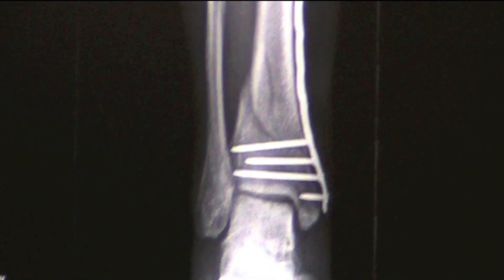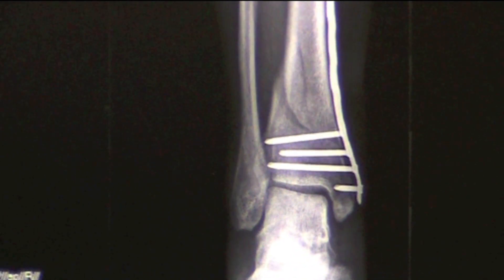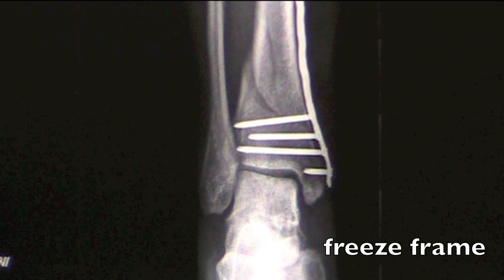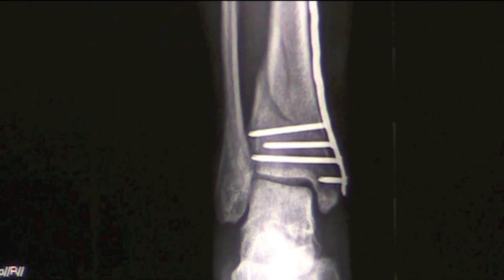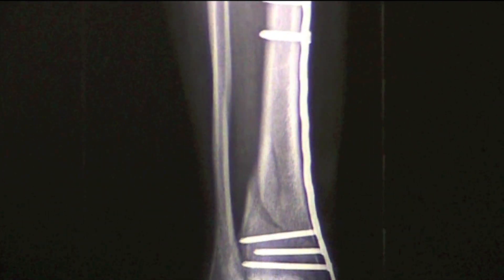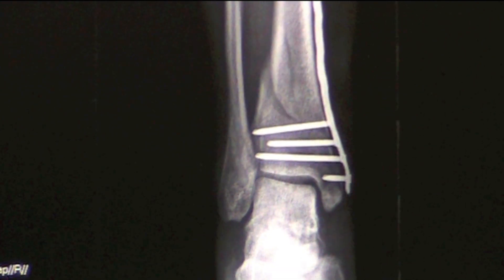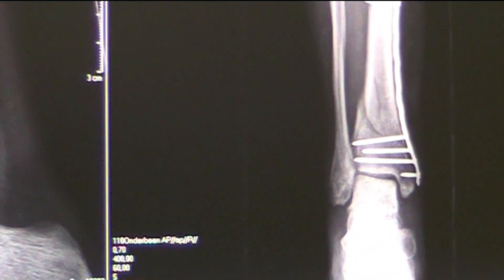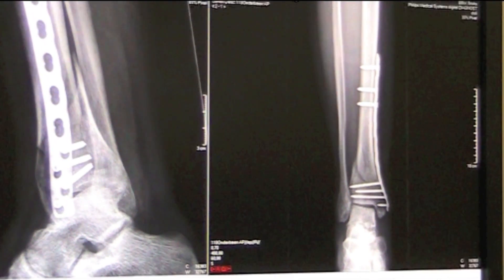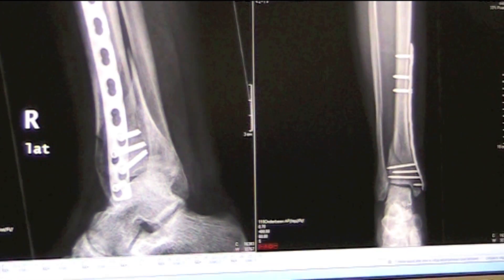You need bone ingrowth to get a mechanically stable construction. Because right now the whole mechanical stability is reliant on this big titanium plate. If you have a sufficient amount of bone, then you can load the bone instead of the plate.